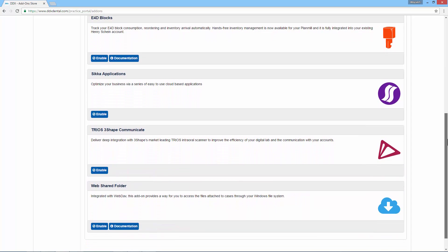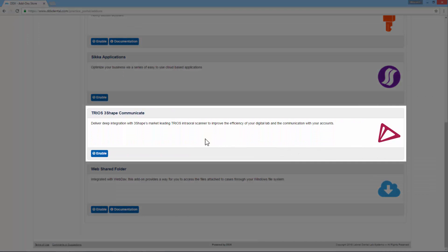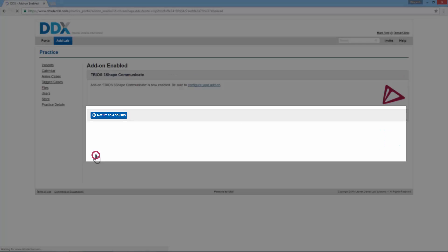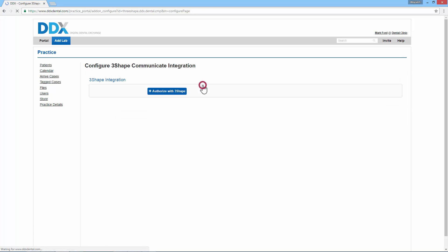Go to Trios 3Shape Communicate and click Enable to initiate the pairing. Then click the Configure your add-on hypertext.